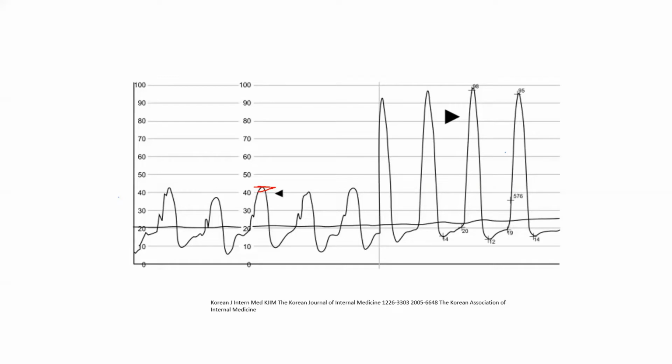Now you get damping when? Damping means an actual drop in the pressure. This means that you have created an obstruction adding on the serious obstruction which is already there, and you induce ischemia and the blood pressure decreases due to that. So damping is serious. That's why you have to hit and run. You have to do it so quick. So ventricularization is against the wall, while damping is actual obstruction imposed by the catheter.